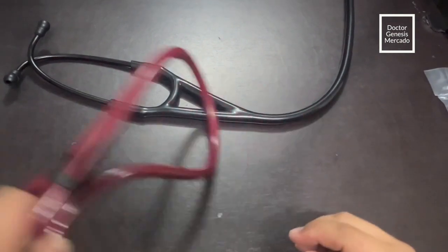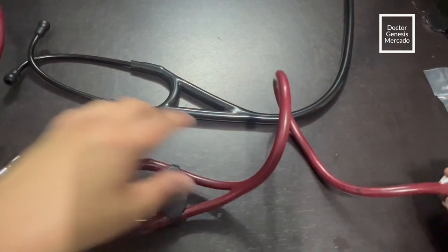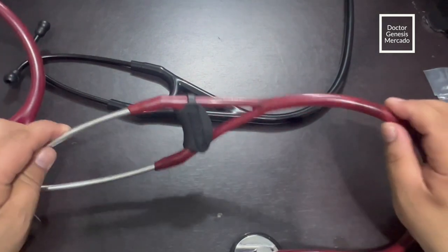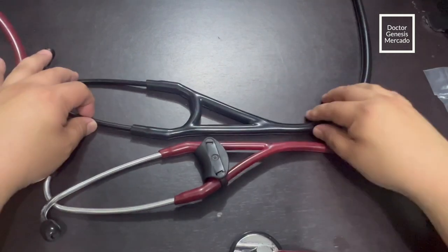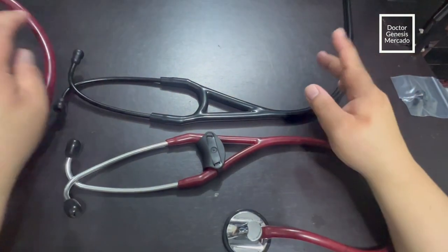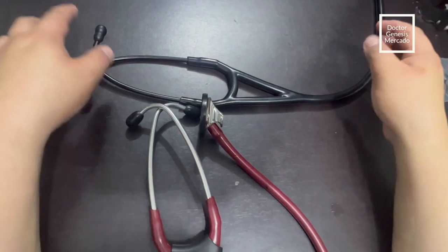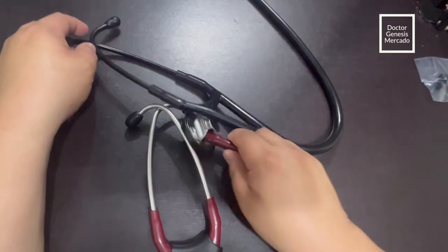And this is the other stethoscope. This is my Master Cardio stethoscope. So we will compare it. Actually, this tube is also a replacement tube. We will compare it to this one. So they are actually similar. So we will try if this tube will fit the Master Cardio stethoscope.